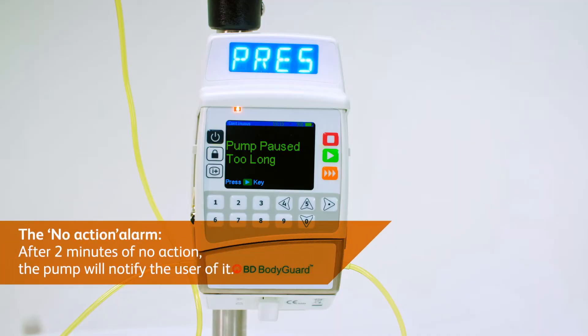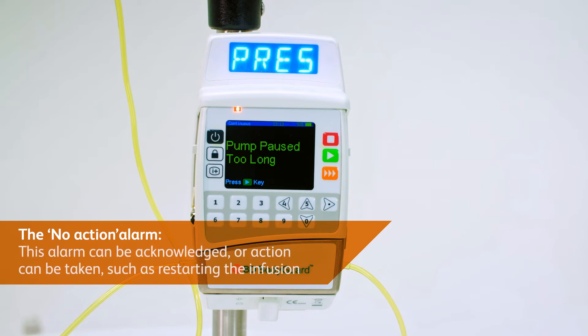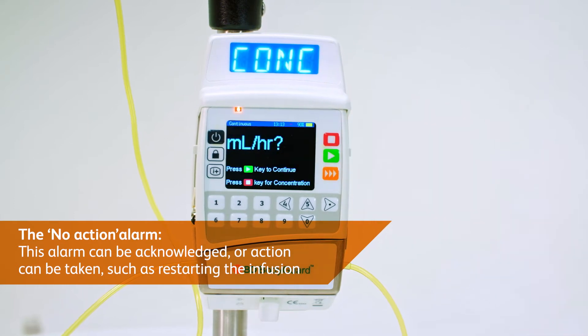The no action alarm: after two minutes of no action, the pump will notify the user. This alarm can be acknowledged or action can be taken, such as restarting the infusion.